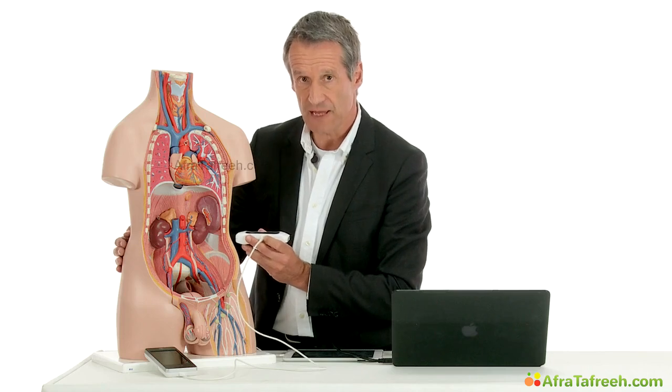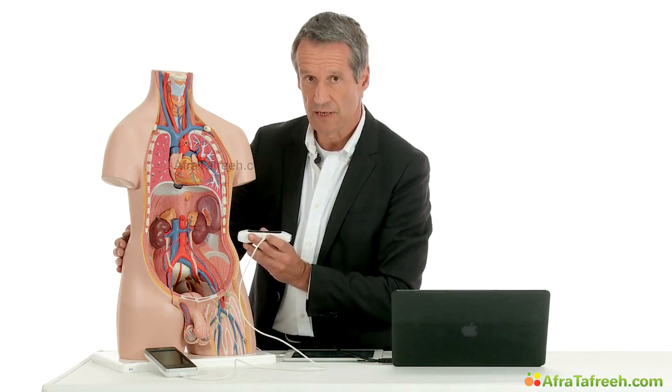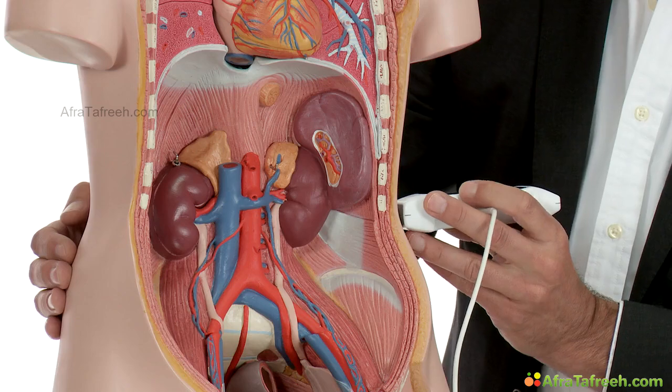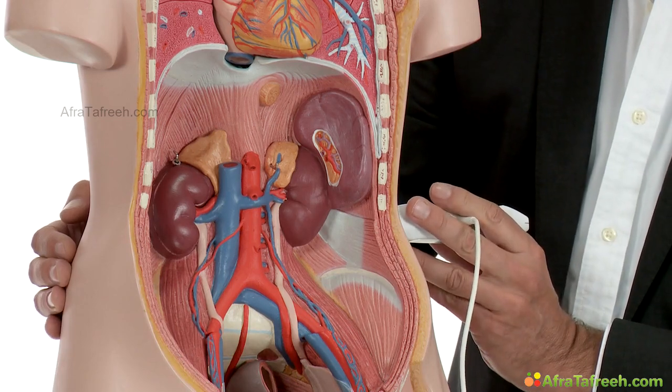Especially for the scanning of the left kidney, it can be very helpful if you ask the patient to turn around so you have the possibility to avoid the bowel gas on the left side.